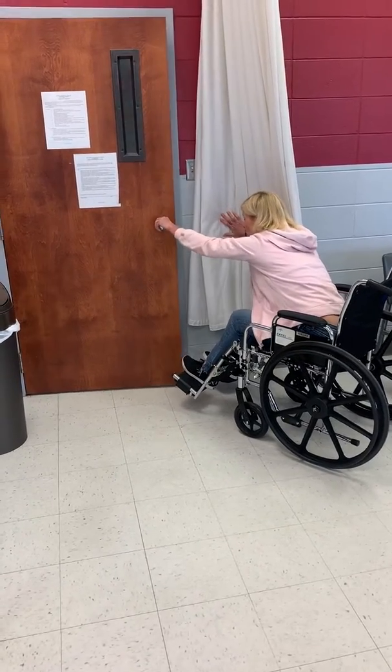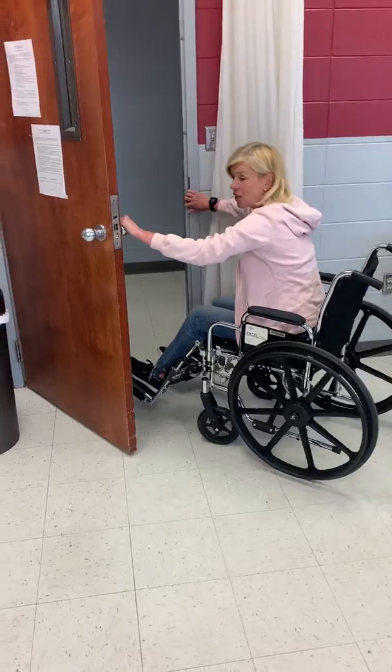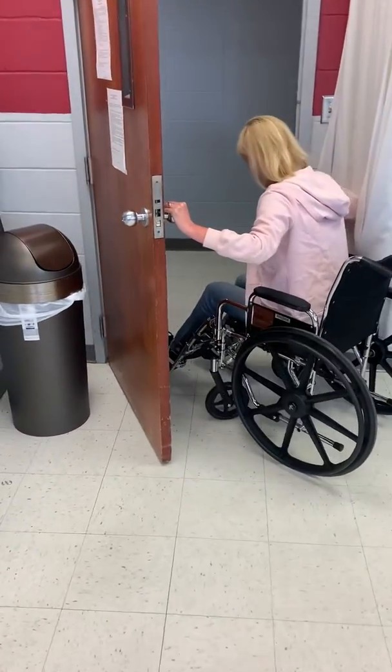So you're going to lean forward, you're going to open the door, and then you're going to pull yourself through this way.